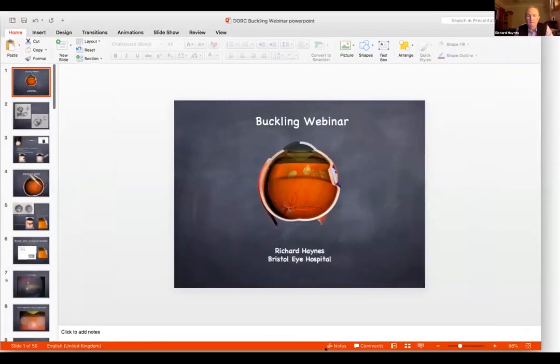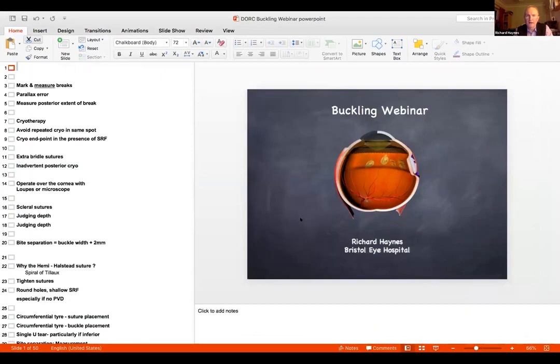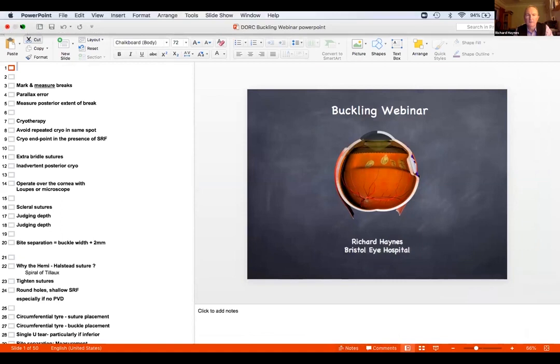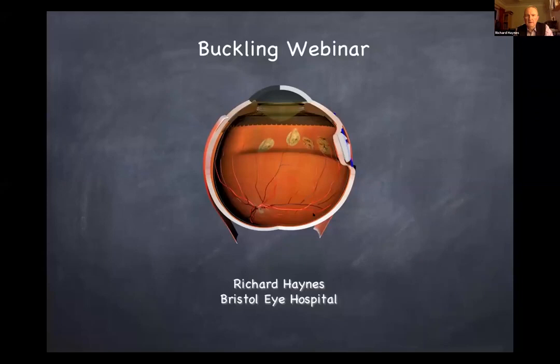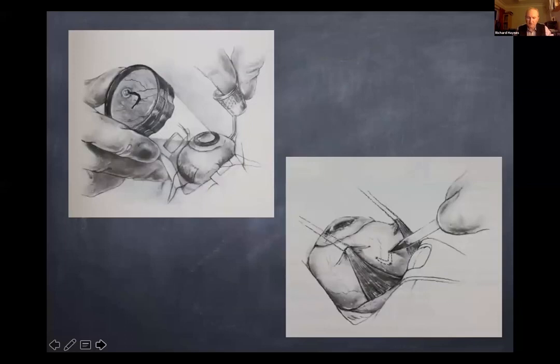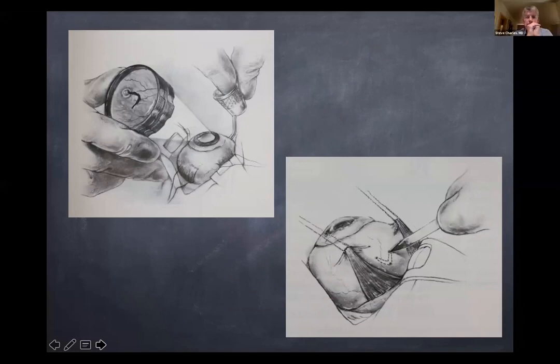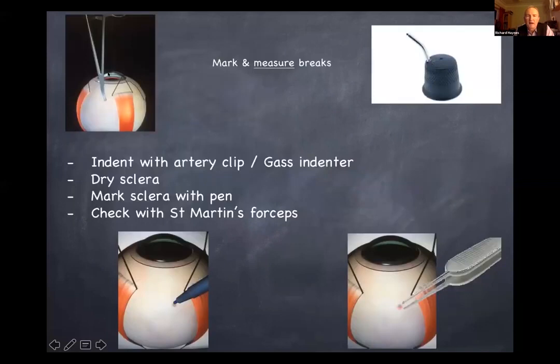Thanks, Steve. Once you've done your pre-op assessment and prepped the eye by slinging the muscles, the next thing to do is mark the scleral position of the retinal breaks. You do that using an indirect ophthalmoscope with a 20-dioptre lens and indenting underneath where the breaks are — that produces a mark on the sclera which you then mark with a pen. You can also do this with a curved artery clip, which is nice because it allows you to slide around until you're right underneath the break and then press firmly to leave a mark.